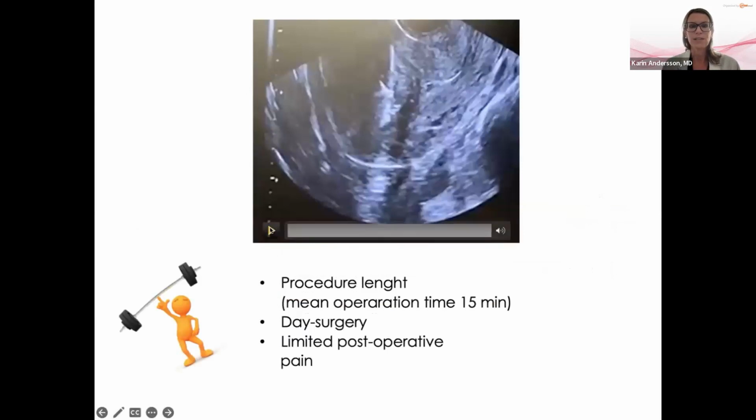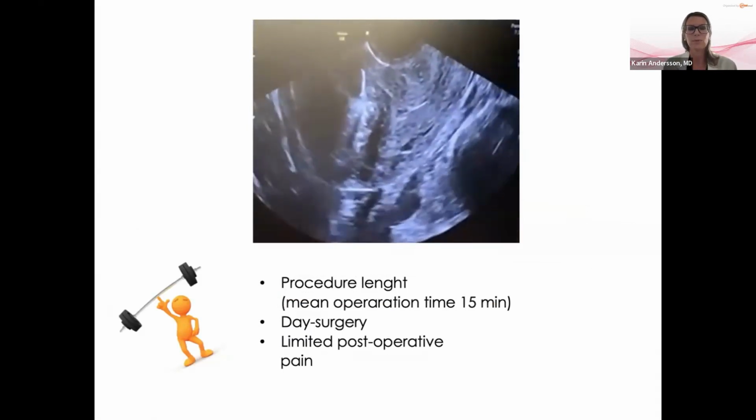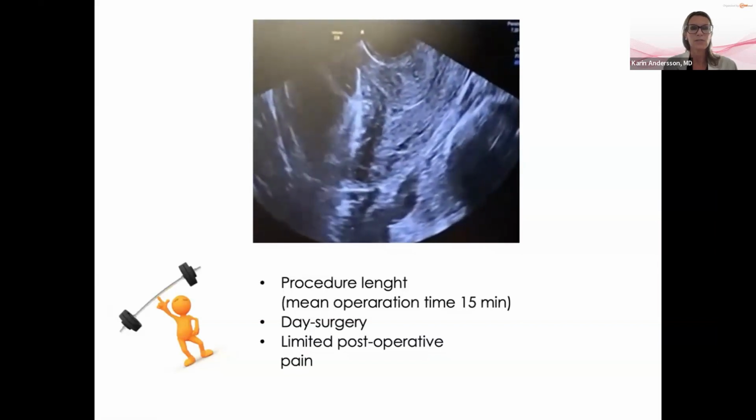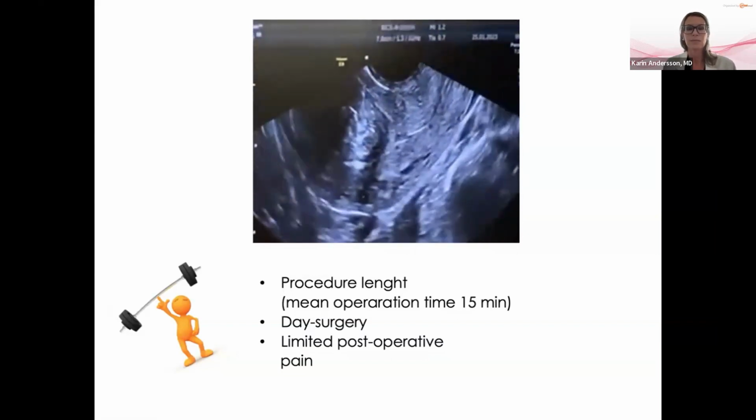So what we can say in strengths of the procedure, I would put the procedure length as one of the very big strengths when introducing this activity in your setting, because besides being a day surgery procedure, where you don't have to stay overnight, it's also very quick. Depending on how your organization is, it's easy to do 6 or 8 procedures in one day surgery setting.